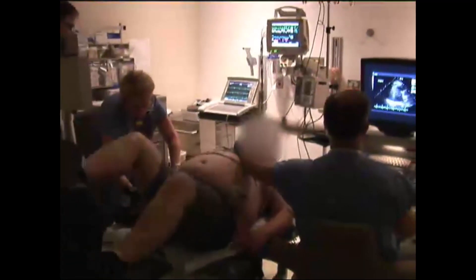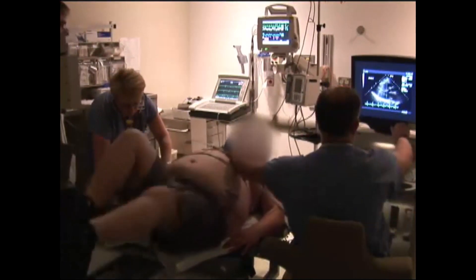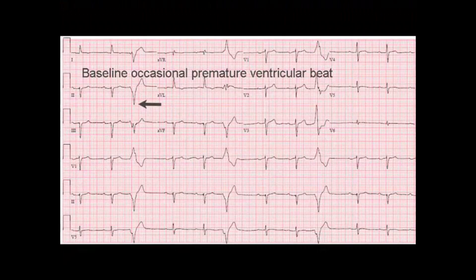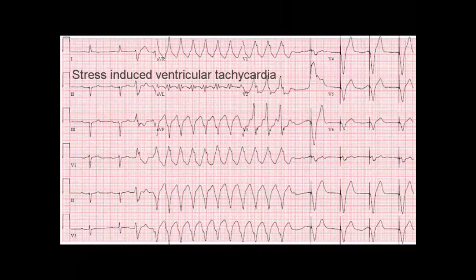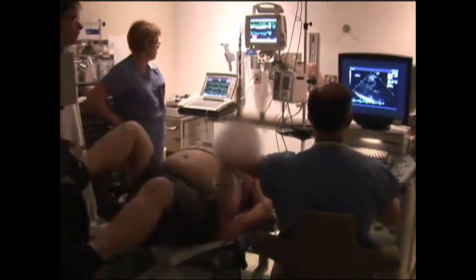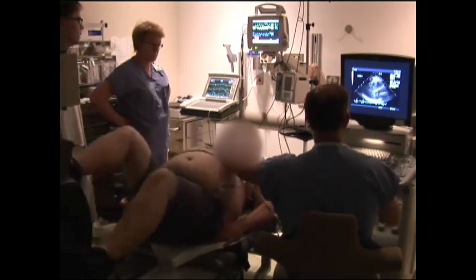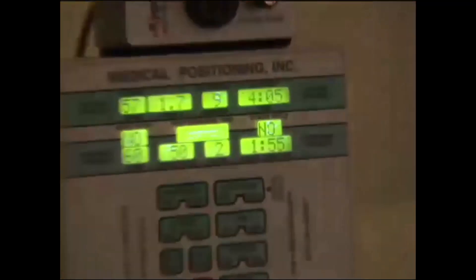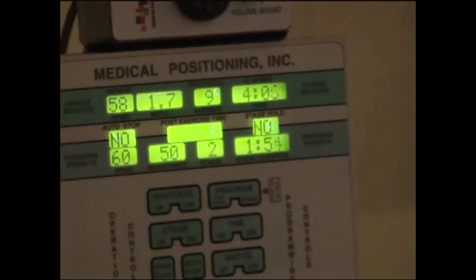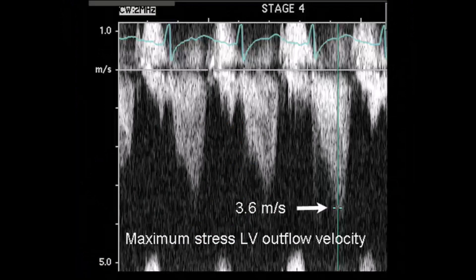The patient's symptoms are monitored closely. Ask the patient if they are having any symptoms at each stage or with visible change in patient status. If rhythm abnormalities occur, record the rhythm for further evaluation. During each stage or at intervals decided by protocol, echocardiographic image acquisition should be performed. The same data should be acquired at each time period as was acquired at baseline. Here we show the peak left ventricular outflow tract velocity determined by continuous wave Doppler obtained during exercise, in the same patient as shown at baseline.